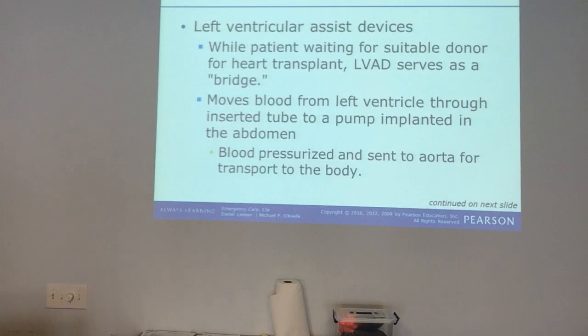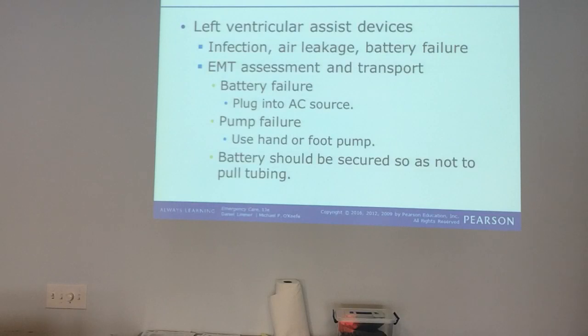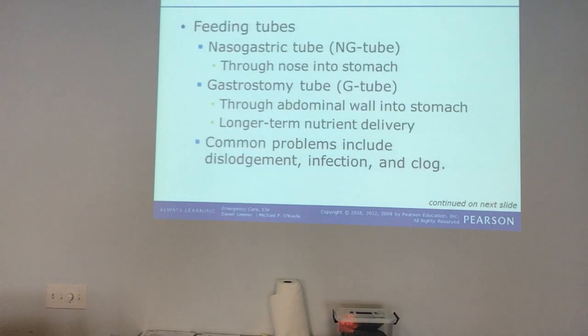It moves blood from the left ventricle through an inserted tube to a pump implanted in the abdomen. Blood is pressurized and sent to the aorta for transport to the body. Okay, these things are very technical. If they fail, the patient will likely die. LVAD assist devices: infection, air leakage, and battery failure can be our problems. For EMT assessment and transport, with battery failure, we want to plug in that thing as fast as we can and keep it plugged in. Pump failure, there's normally a hand or foot pump we can use to supplement. The battery should be secured so it's not pulling on the tubing.